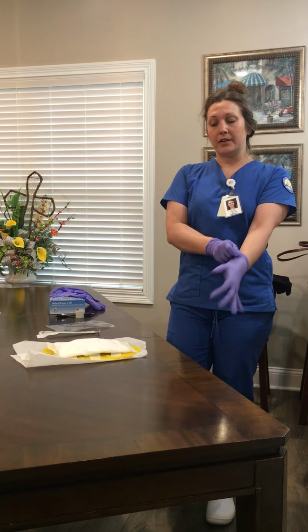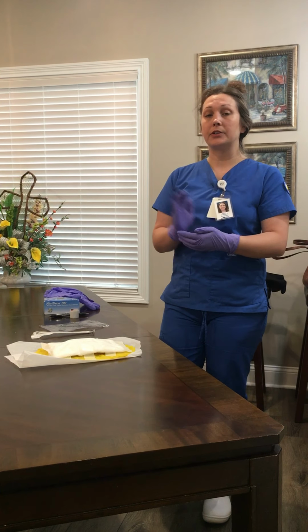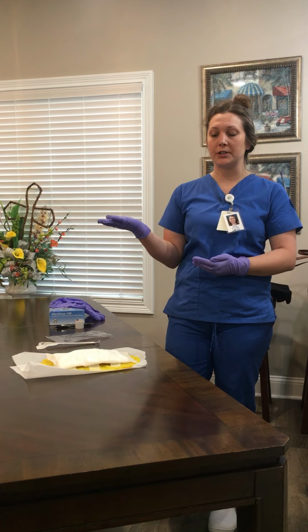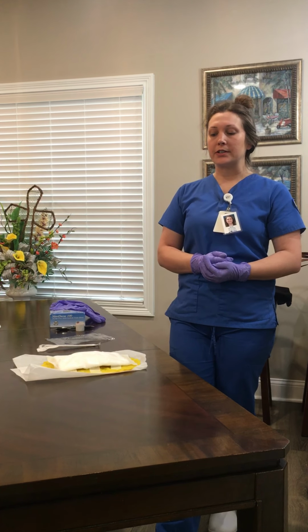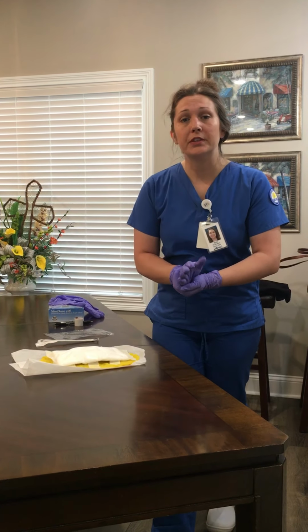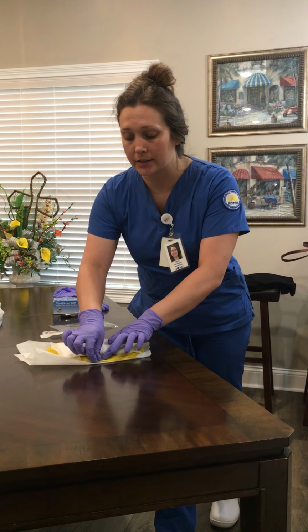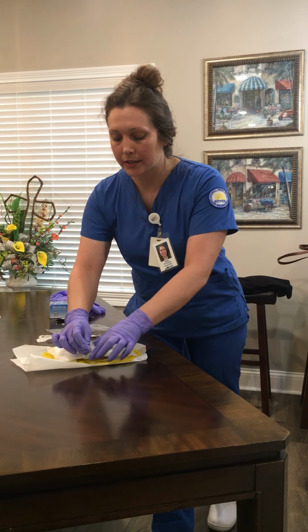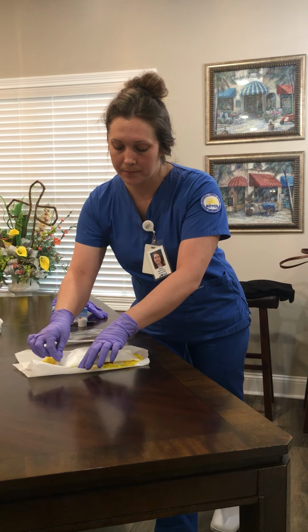So now that we have medicated the patient, knock on the patient's door, identify them using 2 forms of identification, explain the procedure, and now we're going to remove the dressing. So when you're removing the tape off the skin, you want to use some traction just so that it's a little bit less painful for them.